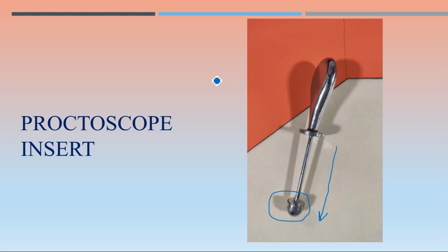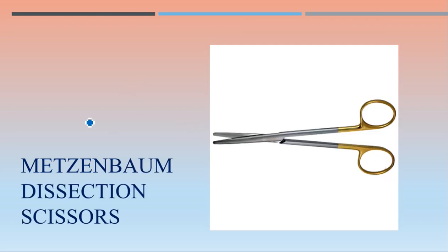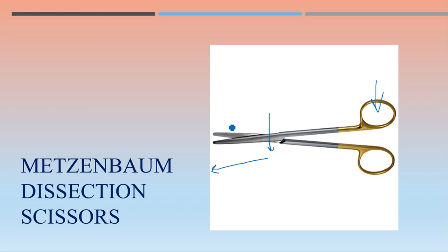The next one is Metzenbaum dissection scissors. It looks like this — the rings are there, it has straight blades, and a slender distal sharp straight tip. The joint is here, and whenever force is applied through the rings, the prong moves in the opposite direction — again type one lever. This is Metzenbaum dissection scissors.